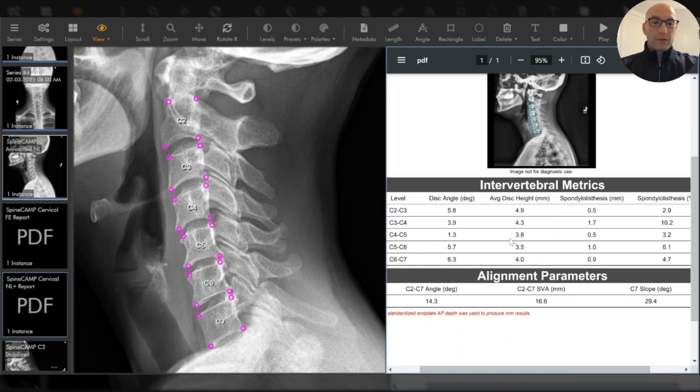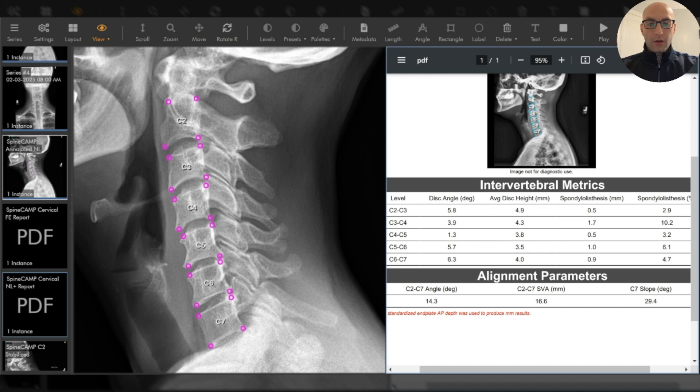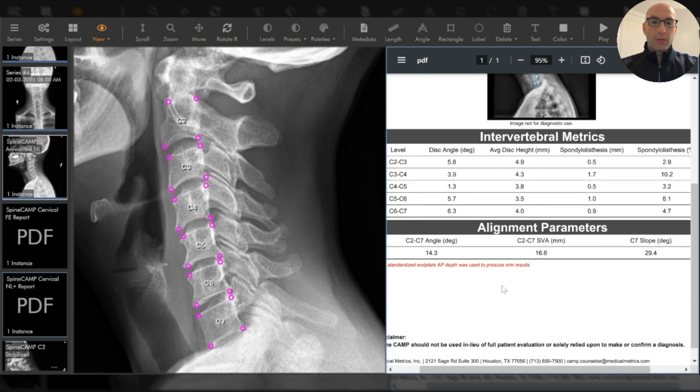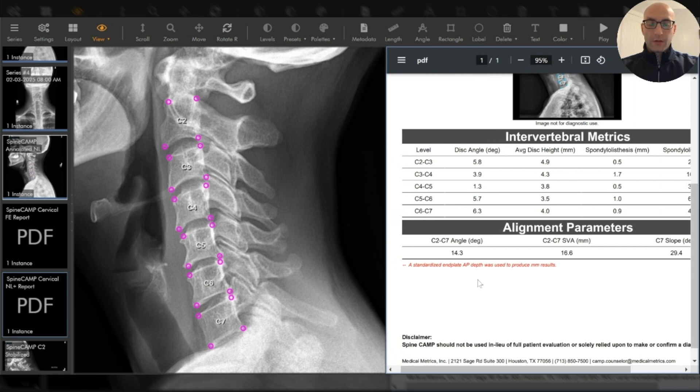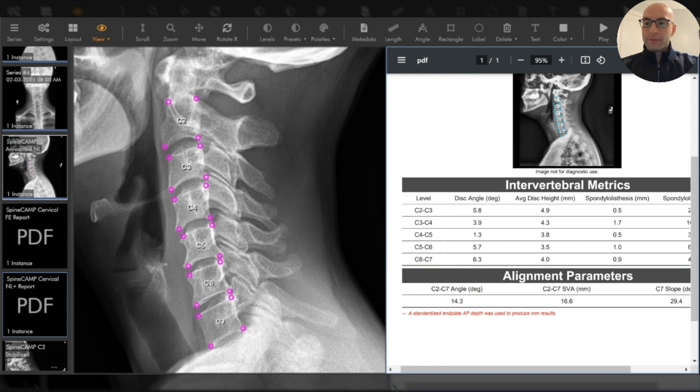Measures like disc angle, disc height, spondylolisthesis, and other segmental parameters are available on demand. You also get C2 C7 lordosis, SVA, and other global parameters in this alignment report.